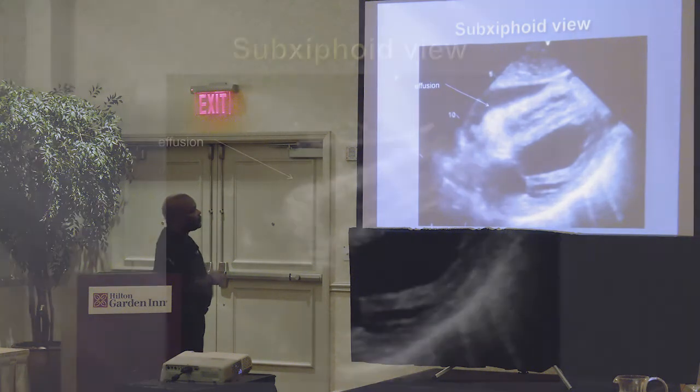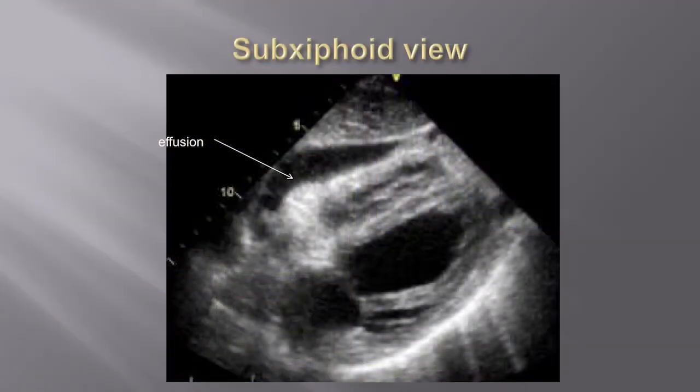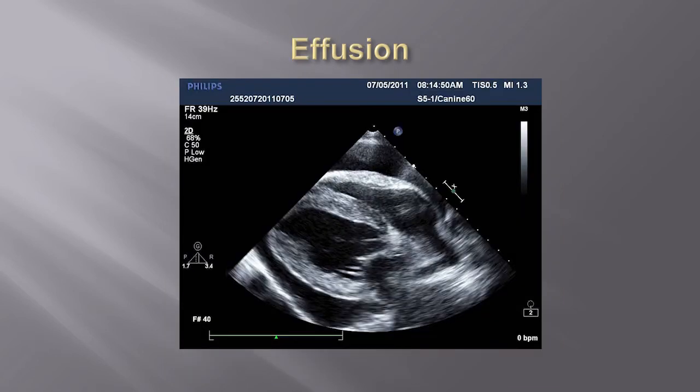Okay, good. There we have again, you can barely see the right ventricle here, all right? Because something is happening that is bothering my preload. So I'm not getting a lot of blood into the heart, but I have a nice dilated left ventricle here, all right? And there's my effusion there. Doesn't mean the person has tamponade unless it comes with a clinical picture. And these little things that we call comet tails, right here, this is what air does when you scan over the lungs. This is what it would look like, all right? There's a nice picture there. Probably what my heart looks like. I doubt it. But you could see a beautiful heart.